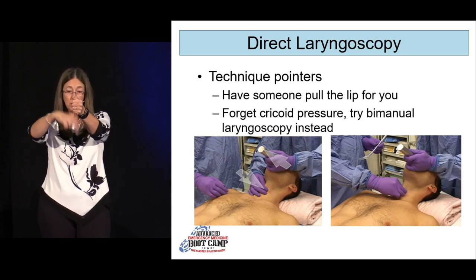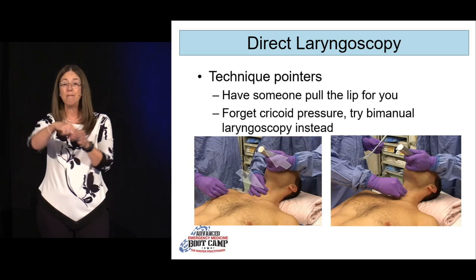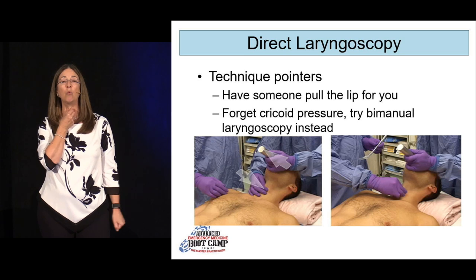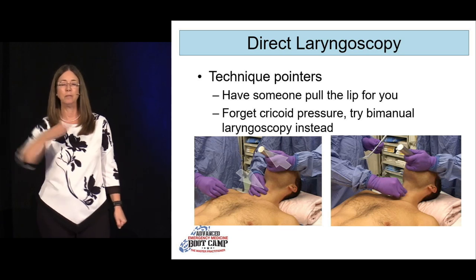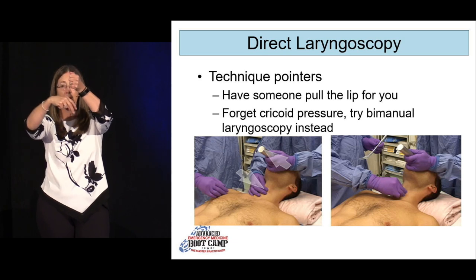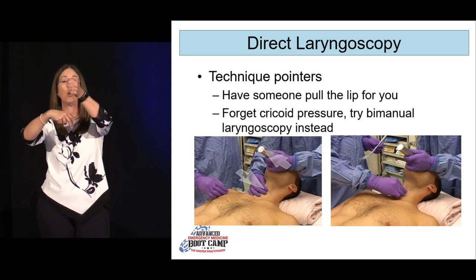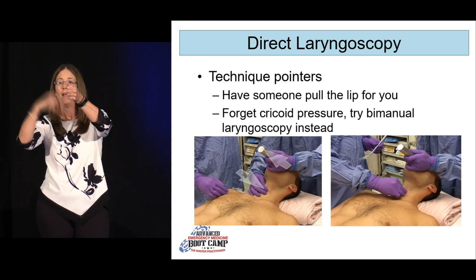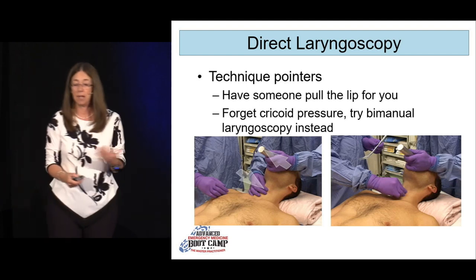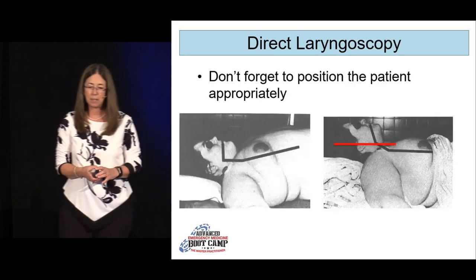So watch and get it to where it's a good position, and then take somebody else and have them hold it right there. Better yet, have the somebody else's fingers there already. Say, here, medical student, come here a second. Put your fingers right there. Now, you reach around, put your fingers on top of theirs, manipulate it around till you see, and then say, hold it right there. Now you have the best view you can get by manipulating the trachea itself to get a better view. It's called bimanual laryngoscopy.